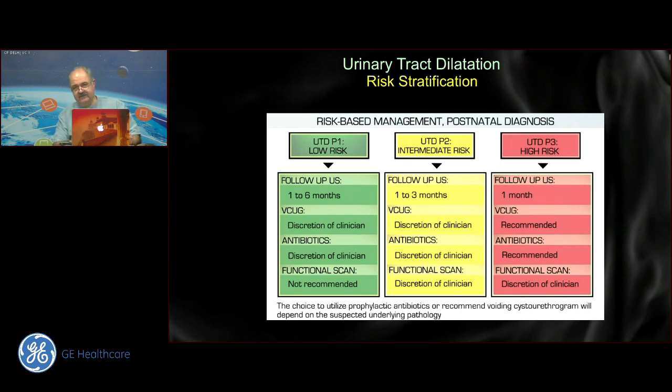Ruptured fetal bladder causes. The most common cause is a critical obstruction of the outflow, invariably. The second cause is iatrogenic. And then you have some of the rarer causes, which some people feel that when a bladder ruptures, that is how exstrophy happens. We know that's not truly the situation. We know that the other possibility that is not truly a rupture of the bladder, that the bladder has emptied out as a urinoma somewhere else, or that a bladder is emptied into the vagina, or that the bladder is emptied into the rectosigmoid. Therefore, you have to be careful on what we call a bladder rupture.